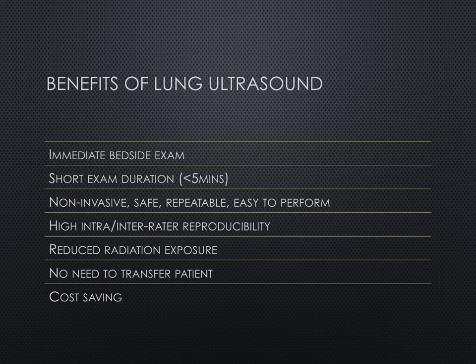It's non-invasive, and it's very safe as a technique. As we know, ultrasound has no distinguishable negative consequences. It's repeatable and really easy to perform for new users within the critical care environment. It's got a really high intra- and inter-operator rate of reproducibility and reliability, and a relatively short learning curve. If you know a couple of basic techniques, you can become pretty proficient pretty quickly. It's really versatile and a really valuable diagnostic tool.